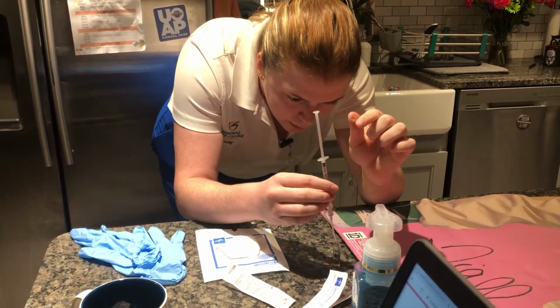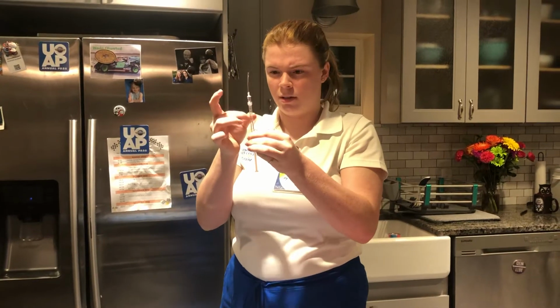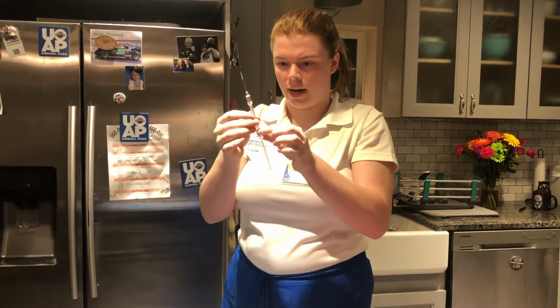Okay. We're gonna get rid of those air bubbles, not infecting the plunger. All right, and then I'm going to go ahead and push it out to 0. Of course, I would do this in like a safer environment where, oh, we get all those bubbles.